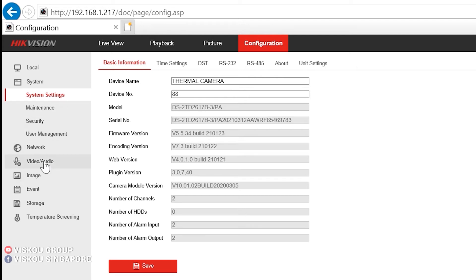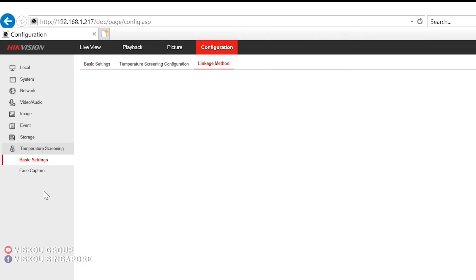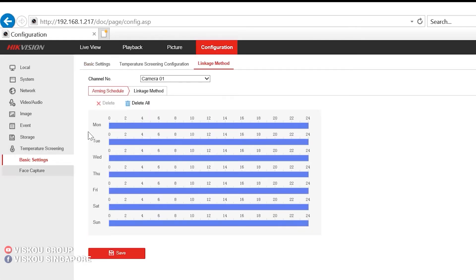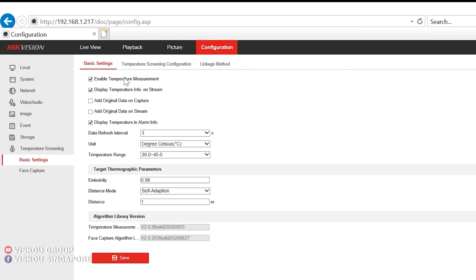So how to do the configurations? First, you can go to temperature screening, basic setting.